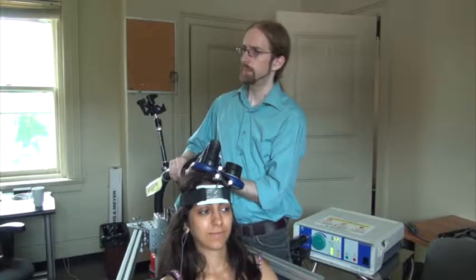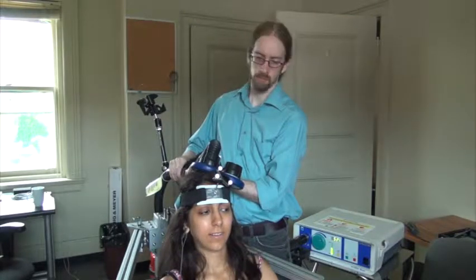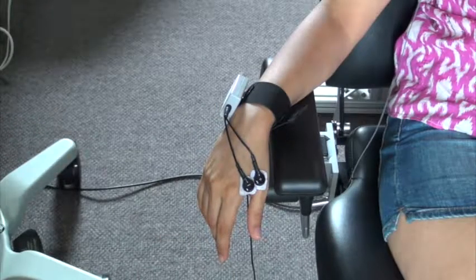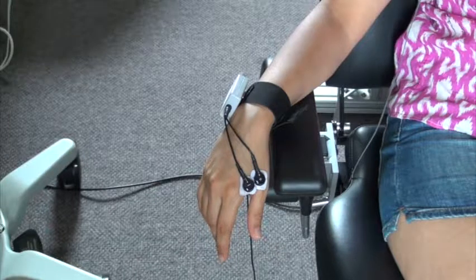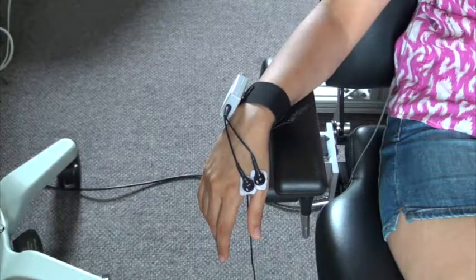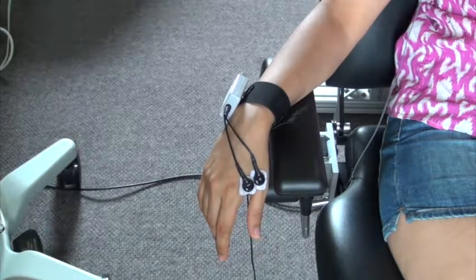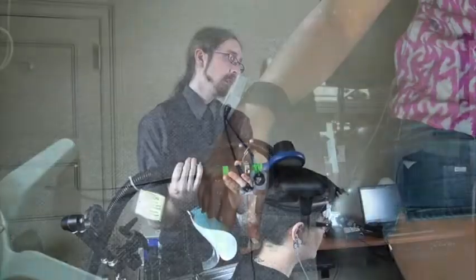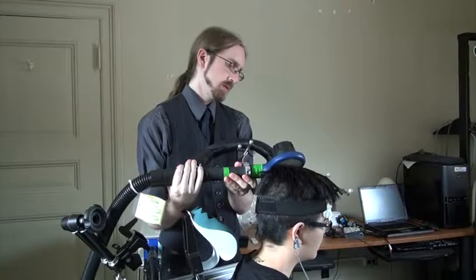Single pulses from the coil are used to stimulate the M1 hand area on the motor cortex in order to measure the RMT, or the minimum strength of the pulse required to cause a twitch in the participant's hand. This value is used to calculate the strength of stimulation for the targeted brain region for each participant.